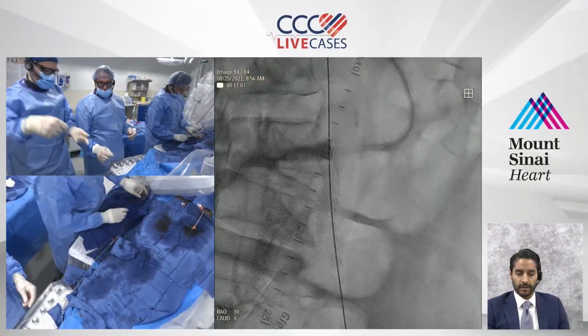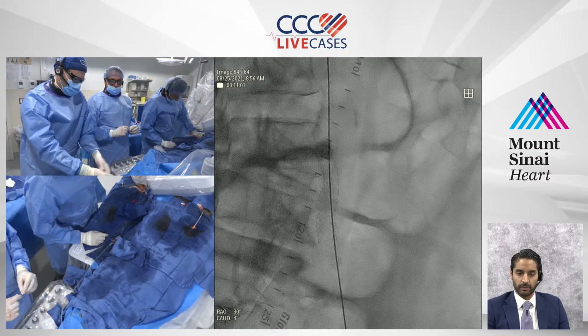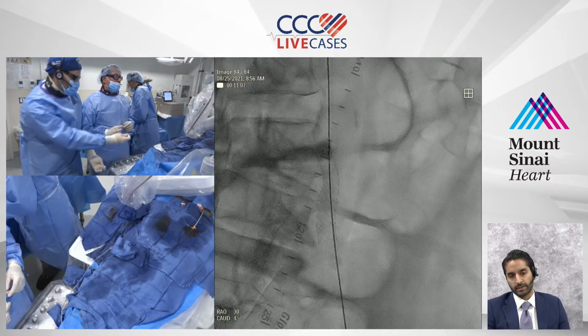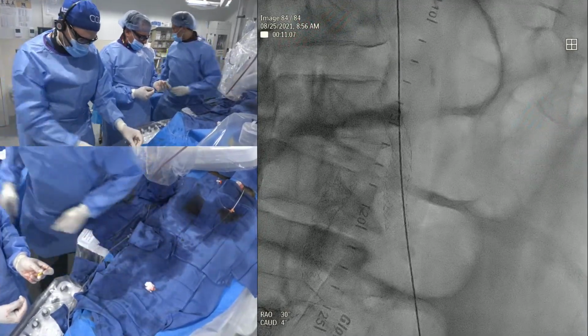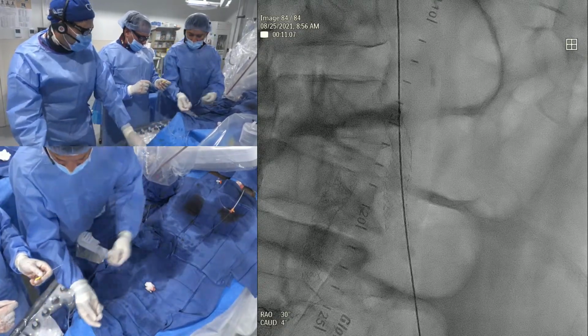A question for you guys there. If we do find that there is a gradient in the external, and we do decide to stent across there, would you go with a balloon expandable or a self-expanding stent? I think at this stage, because you have the mismatch, a self-expanding stent may not be a bad idea. The problem is you want to have it very smooth.